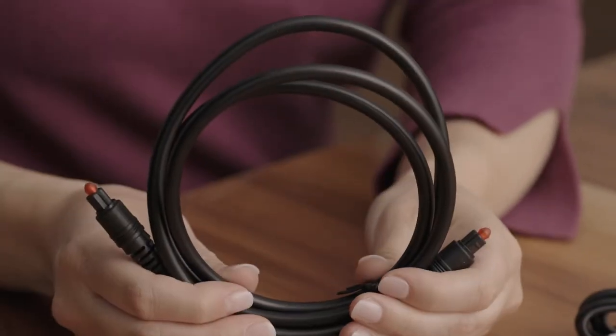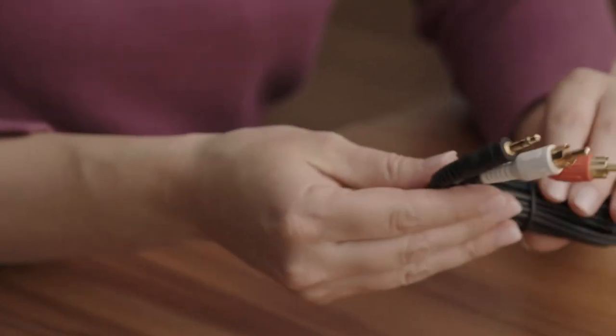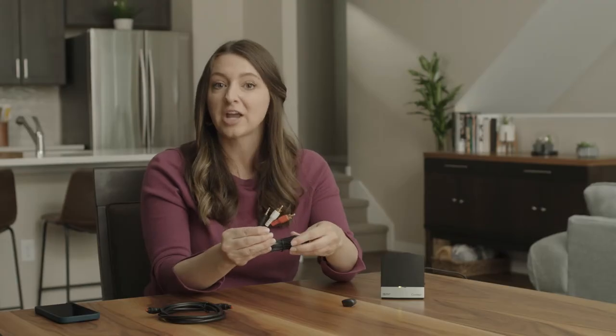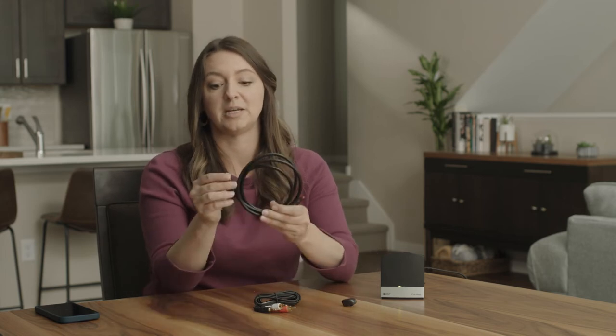Your Baja 6 Max will sound ascending beeps to indicate the pairing was successful. Place your sound processor back on your head. Now that your processor is paired to your TV streamer, plug in either the optical cable or the stereo RCA cable into the back of the TV or cable box and connect it to the back of your TV streamer. If you use the optical cable, please remember to remove the protective tips before use.